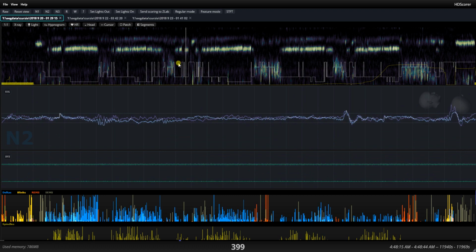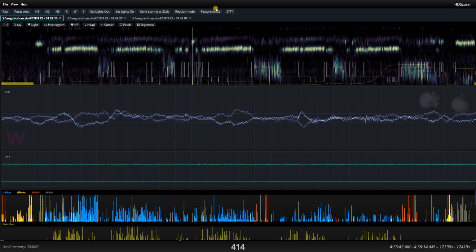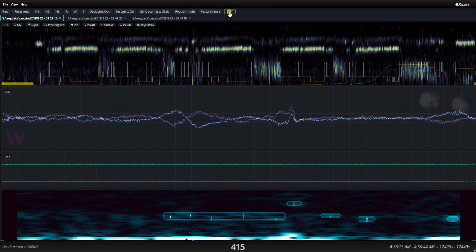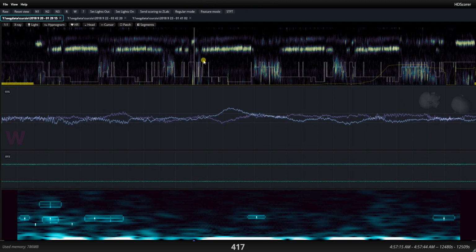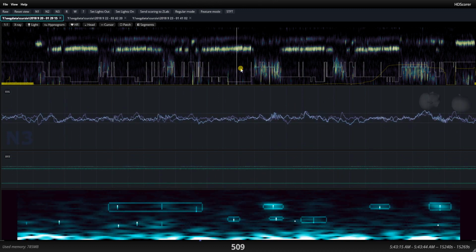Another awakening right here, which was caught on the hypnogram. Another awakening with a lot of alpha waves. Let's visualize them right here. A lot of alpha right here. Okay, so all of this is very, very accurate.